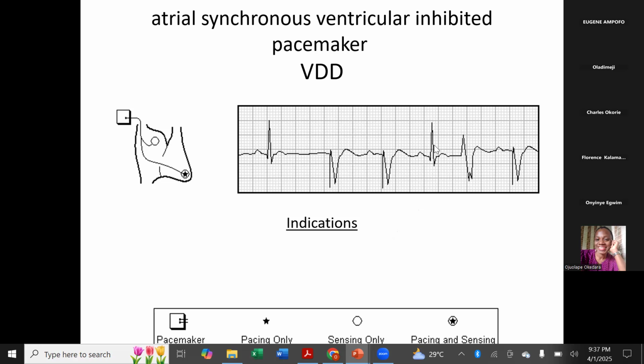You mean this? Fourth is, yes. This is 1, 2, 3, 4. This is a normal intrinsic activity now. Okay. Compare it to this. Compare to the first, right? They look the same. QRS look the same, right? But it's different from this, right? Yes, it's different from that.